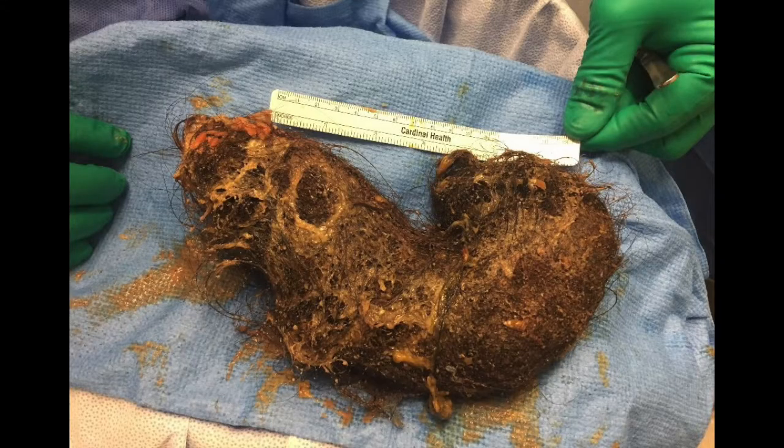Once the gastrotomy was closed, the 11x11x5cm specimen was extracted using a 5cm Pfannenstiel incision, which was closed in layers. Local anesthetic was infiltrated into the wound, and bilateral transversus abdominus plane blocks were placed to ensure adequate post-operative analgesia.